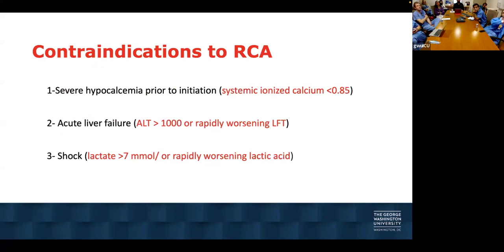So the contraindications: the nurses will not let you do it unless they look at those and make sure the ionized calcium is not below 0.85. If it's above 0.85 but not up to 1, you can give 2 calcium gluconate. They have a protocol for that.